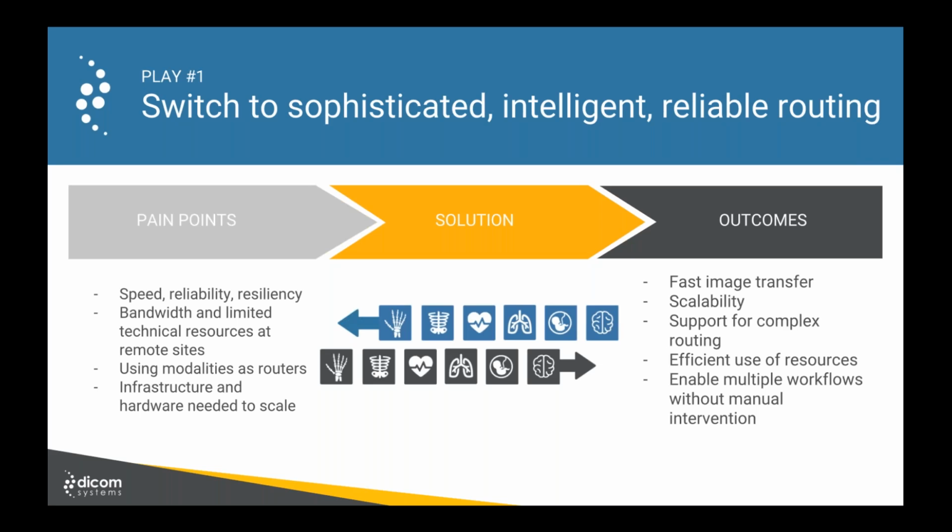I think one of my favorite examples is, I'm not sure if there's anyone out there running Fuji PACS, but if you have a Fuji plain film, Fuji CR and a Fuji PACS, when those two get together and you try to export that data out of Fuji PACS, we found that we were having a lot of problems with the format in the Dicom.